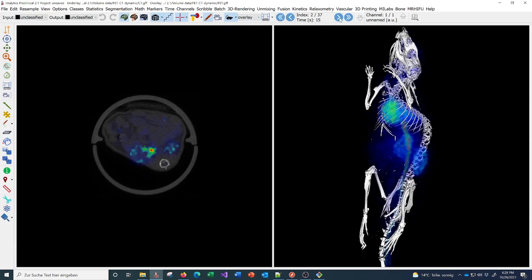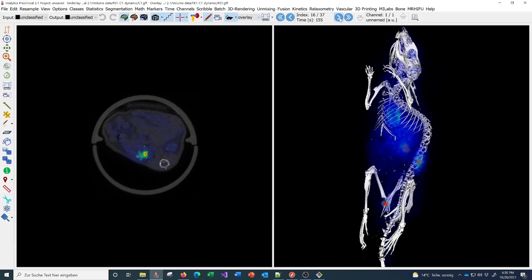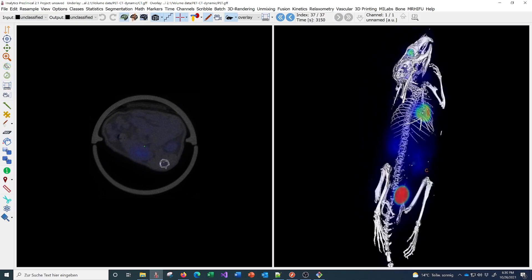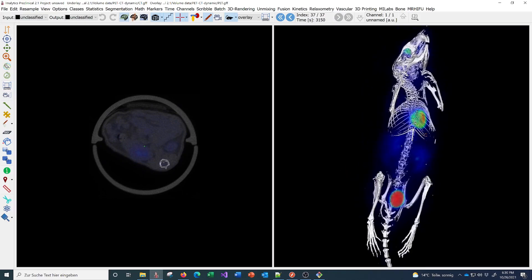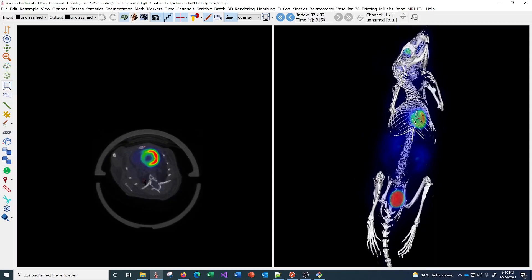If I go to the overlay, I can now go through the time points and you can see how the contrast agent goes through the mouse and accumulates in the heart, for example, and in the urinary bladder. Then you can segment a region.